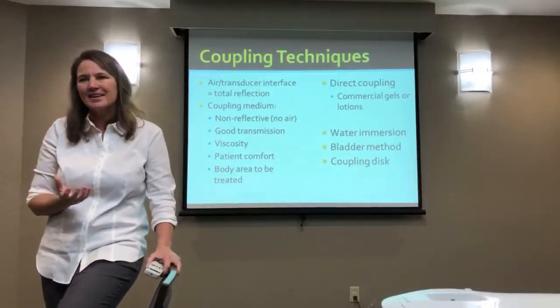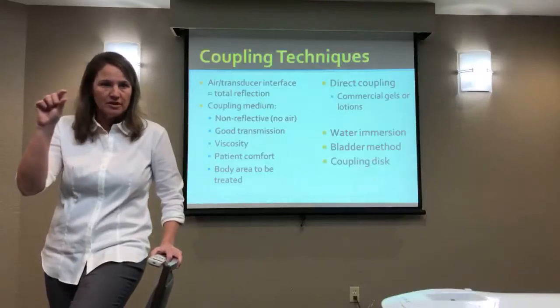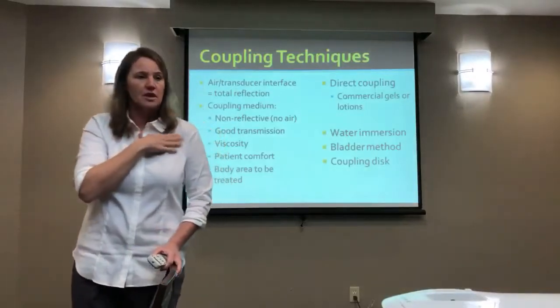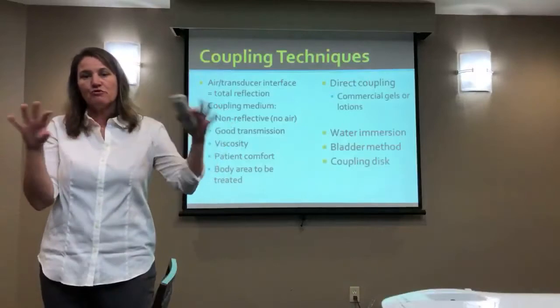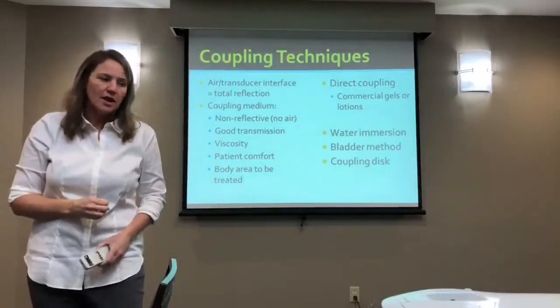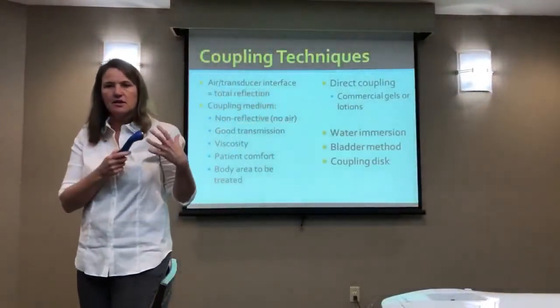I've never seen why you would, and to be honest, any gel I've ever used, there's no way I'm going to maintain a level that's going to stay there, because what you'll notice is when you put gel on or lotion, whichever you're using, as you start doing your ultrasound treatment, it starts to dissipate and move, and you end up with a mountain of gel around the edge instead of in the middle. So what I usually tell people is try to make sure you pick a sound head size over an area that is adequate.